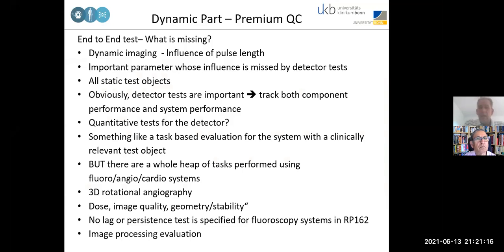So this was actually everything I would like to give you. Now we come to the measurements you have seen. They are static, aren't they? And I didn't talk anything about dynamics. It's always static. So what do we do with the dynamics? You will see that so far there is no recommendation and no guideline for dynamic imaging.